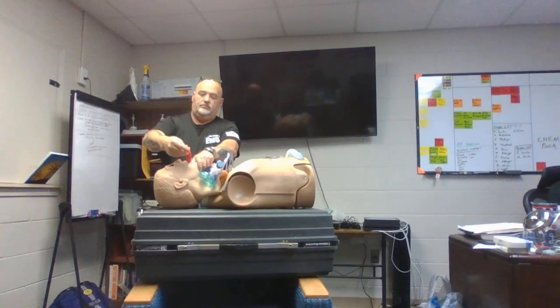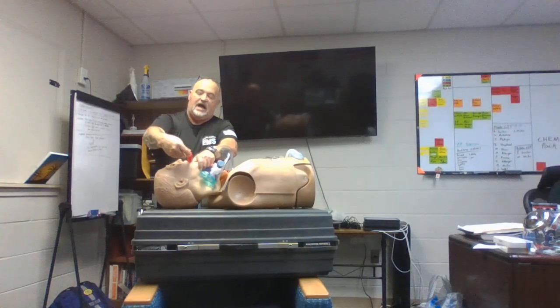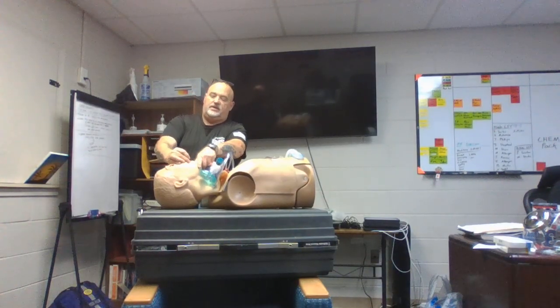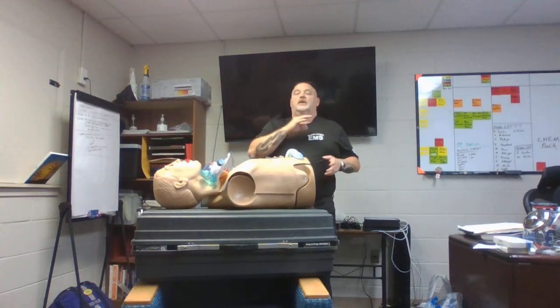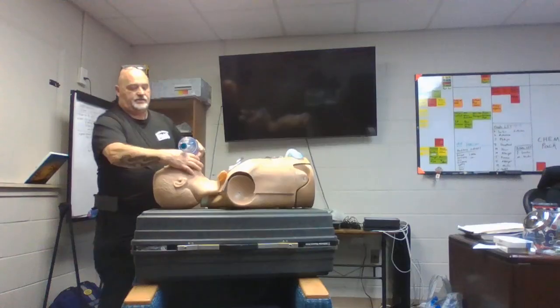Look, I'm doing it. Some people go all the way backwards. I like to go from the side at an angle, and when I go down, I just work it right on down straight. And what it's doing is it's pushing that tongue up off the back, right? It's holding that tongue up and out of the way. Should give you better compliance.